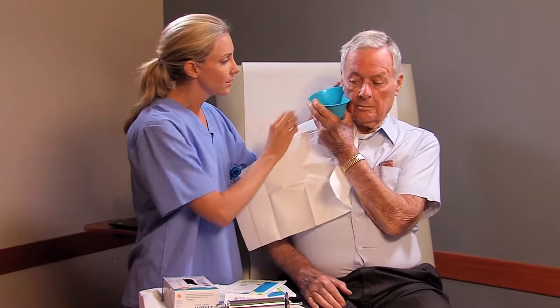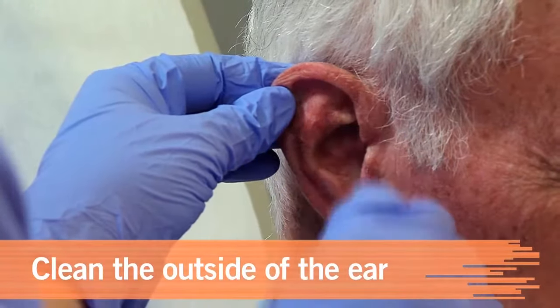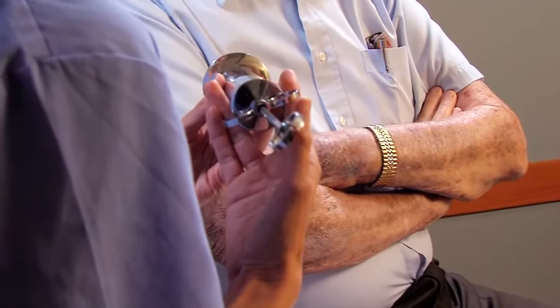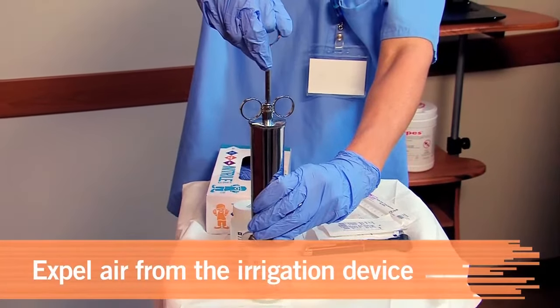The patient can help by holding the basin. Wipe away any foreign particles to avoid introducing them into the ear canal. For the patient's comfort, ensure that the solution is warm, as cold medication may cause pain, nausea, or dizziness. Fill the syringe and expel any air from it.